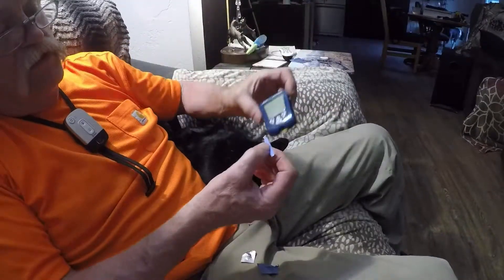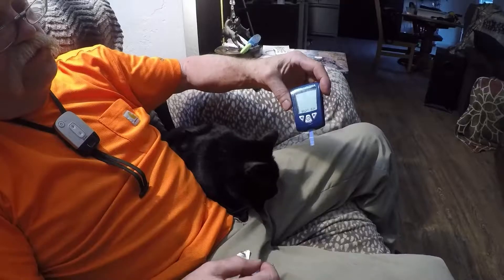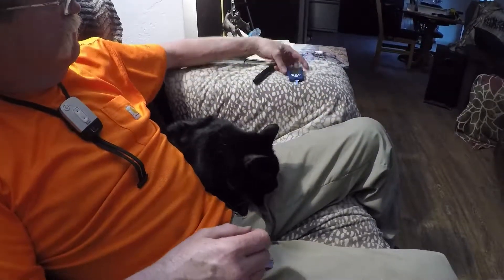Take your machine and plug it in. It'll cycle through. You've got a couple of minutes where you have to draw.